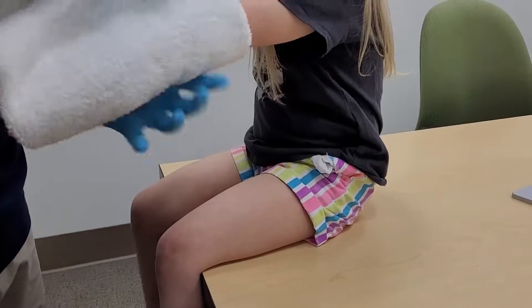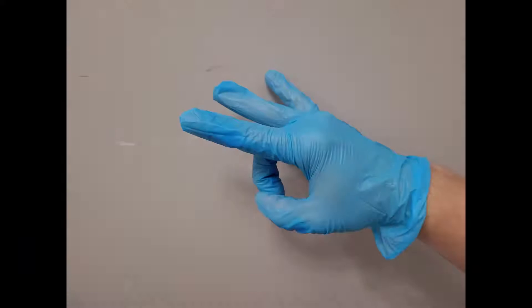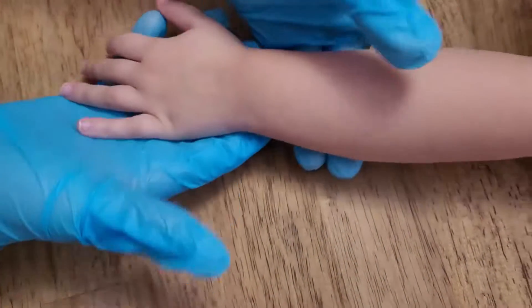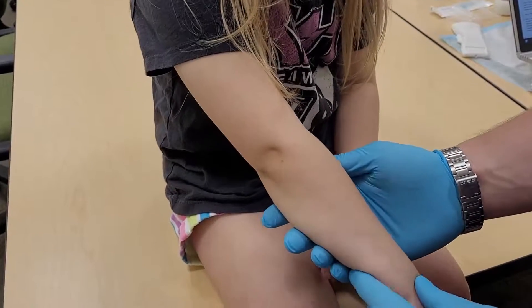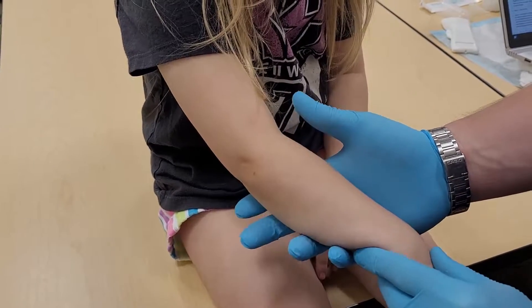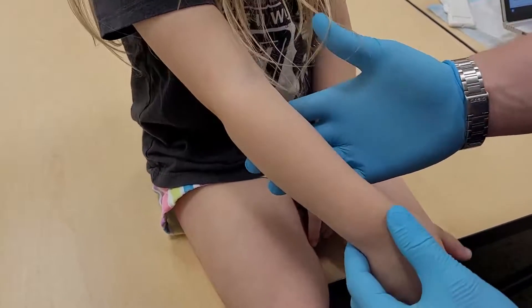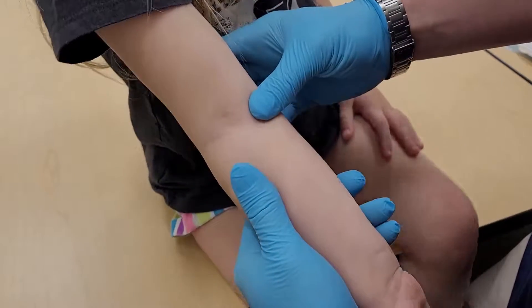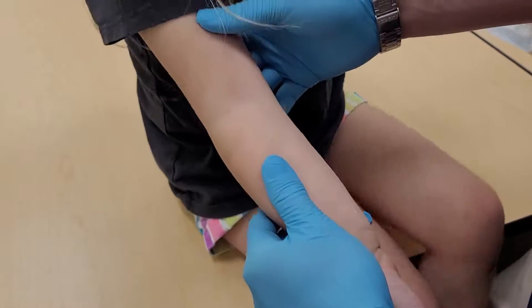A few techniques exist to support target vein identification. Consider wrapping the extremities in warm blankets for a short period of time to help the veins expand. Allow gravity to assist you by having the patient hold their hand or foot below the level of their heart. Flicking of the vein is discouraged in pediatric patients; if stimulation of the vein is still required, it can be done by stroking the vein gently along its length from a proximal to distal direction. Each potential IV site comes with its own considerations. The veins in the forearm are rarely used in younger children, as they may be difficult to see due to the increased adipose tissue mentioned previously.